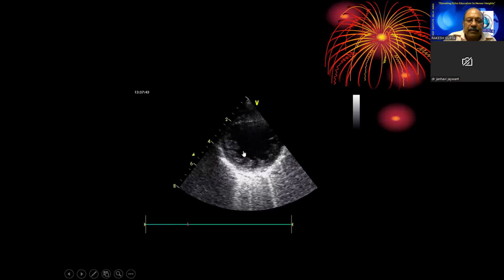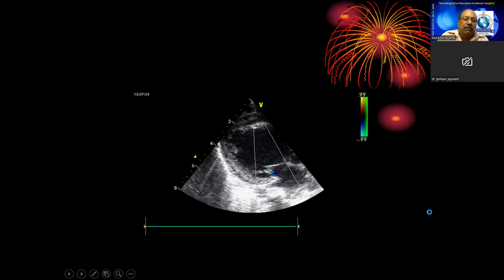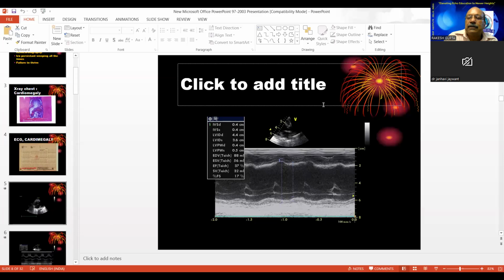This is somewhere at the age of, when did I record it? I don't remember. It's a pretty old collection of cases because it's in an old format. I can tell you it was recorded long back, almost 2003 or 2004.